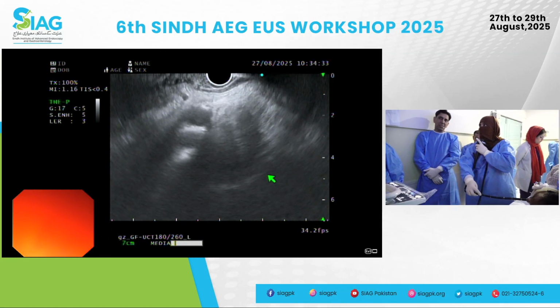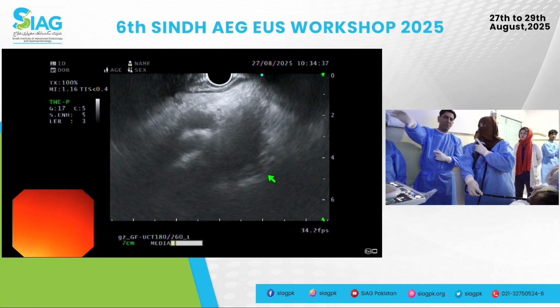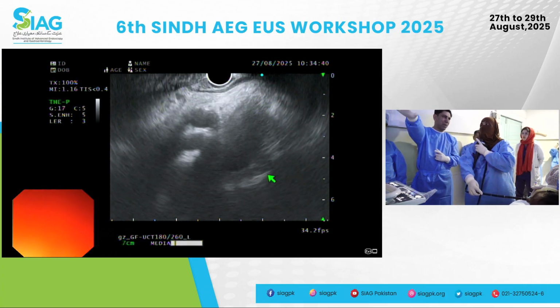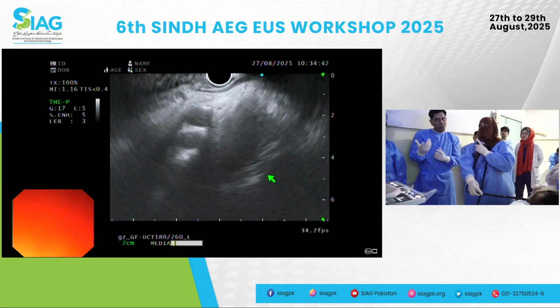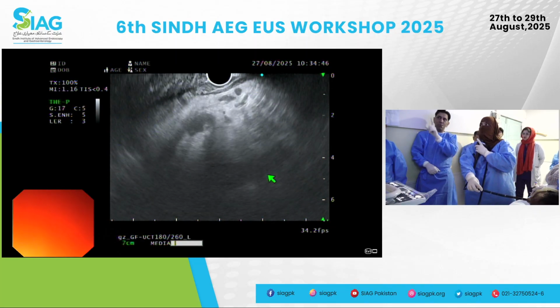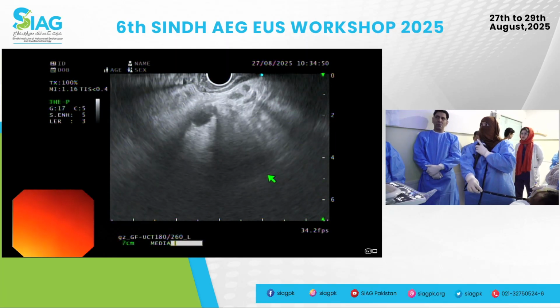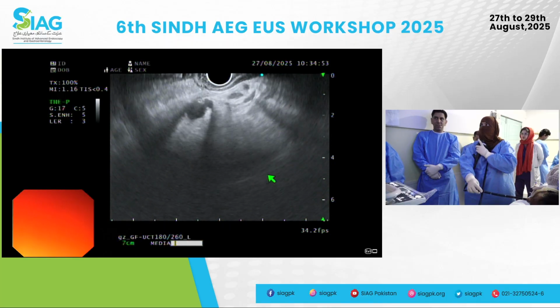One more thing you can give at this stage. Remember our question that's being asked is about the mediastinal nodes. Are there any further lymph nodes around the celiac, any periceliac nodes? Okay, no, exactly. Then there is nothing out there, nothing jumping out. There are some small ones but I don't know, the tiny ones, are they related or not? Okay, so just advance the scope.